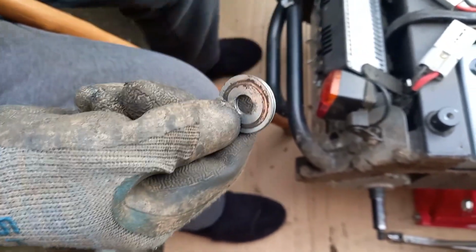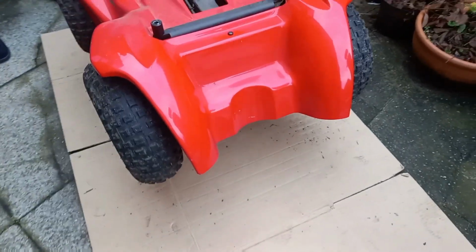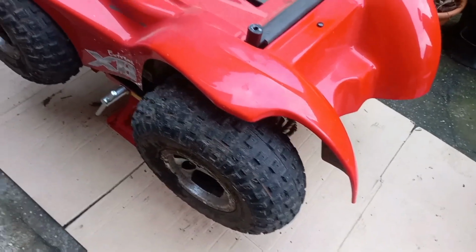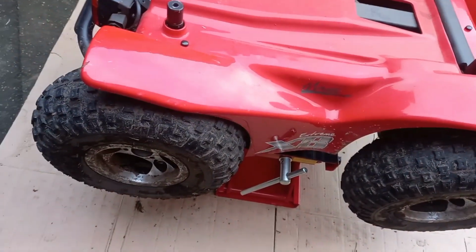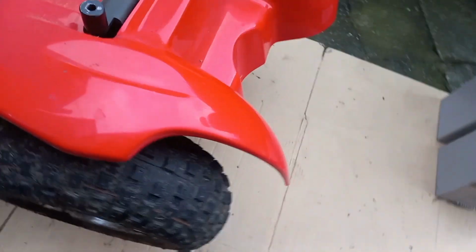But anyway, right, we're just reversing now what we did in the beginning. It's taken us a bit longer than we planned because we've had all four wheels off. We've cleaned them, we've greased them all. We haven't cleaned the wheels, we've cleaned the shafts. Put copper grease on everything. New nuts. So you just got to get the seat back on.